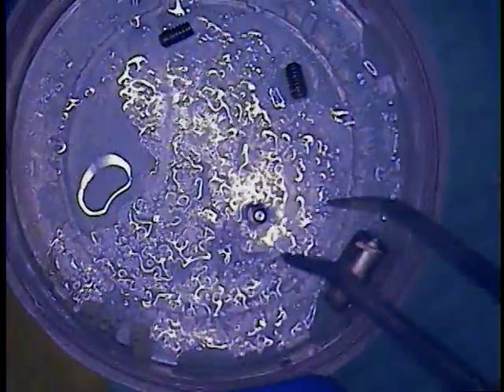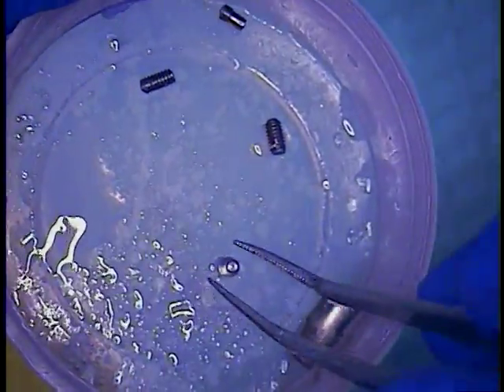The patient is going to be returned to her dentist now to get a brand new bridge made with new abutments. So here are the abutment screws that were removed. There were three of them, but the last one told a little tale about what really did happen.